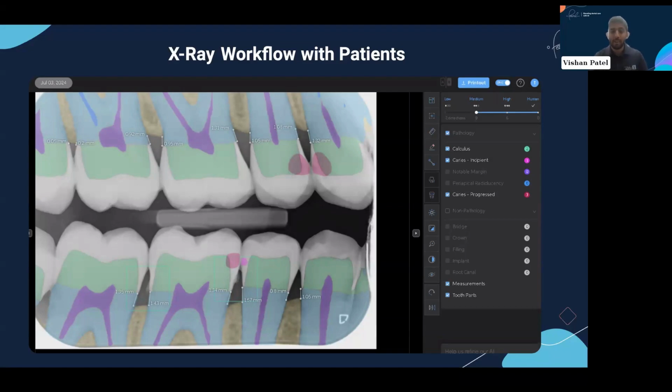Before then, I would move on to little things. So normally with a patient in this situation, I go over the enamel lesion and I talk about how we don't actually need to do a filling here. We can do things like OHI, hygienist, fluoride treatment to try and prevent you needing a filling in the future. At this point, when you're talking about enamel lesions and showing them on the X-ray with Pearl, they can see the color, but they're also normally thinking about, okay, so what's the bigger red, basically? And on some occasions, I've even had patients who self-diagnose that they have caries. So they'll normally say, does that mean I need to have fillings on these teeth with the bigger pink?